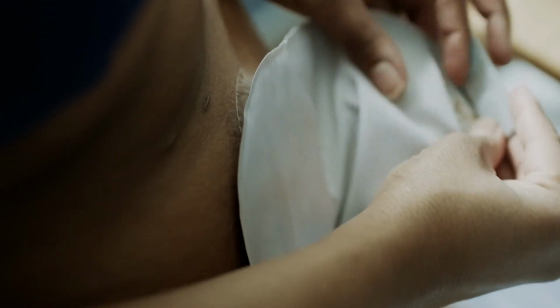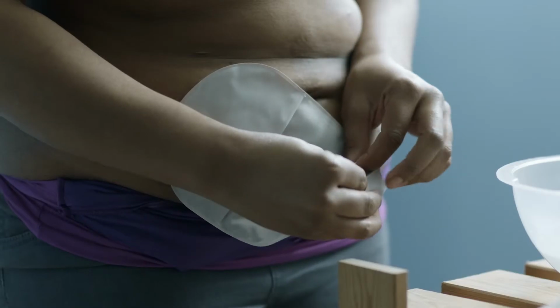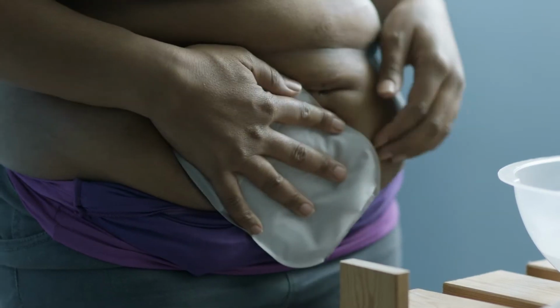Always do your bag up. One time I forgot to do the bag up at the bottom. I will never do it again.